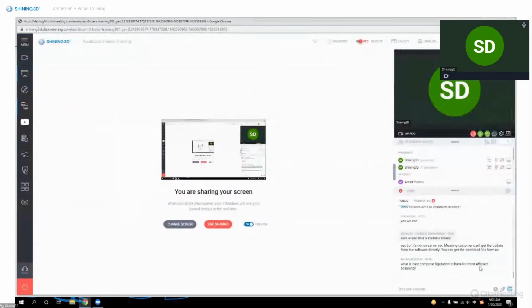Let me check if you have any questions related to it. What is the best PC configuration to have? So my colleague will answer the question for you. He will type something. It will be more clear. Do you have any questions related to the orthodontic simulation function?